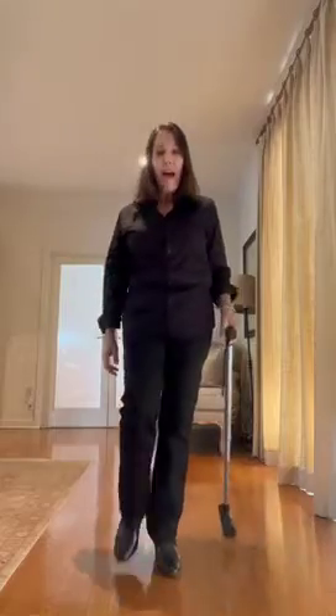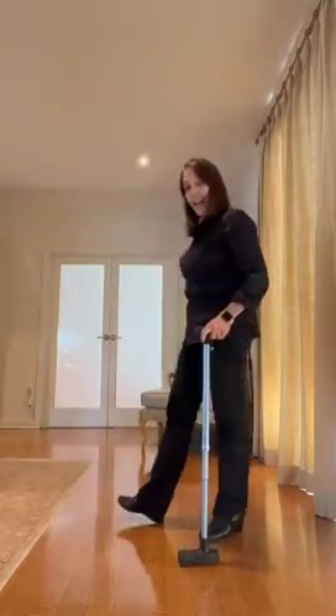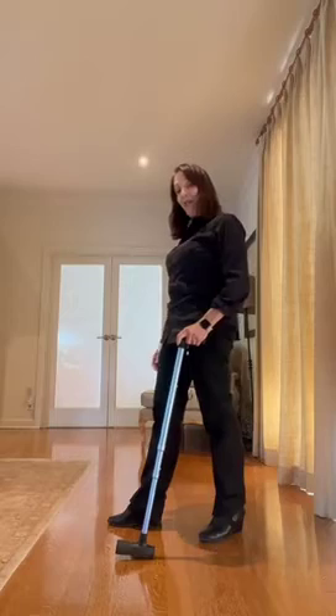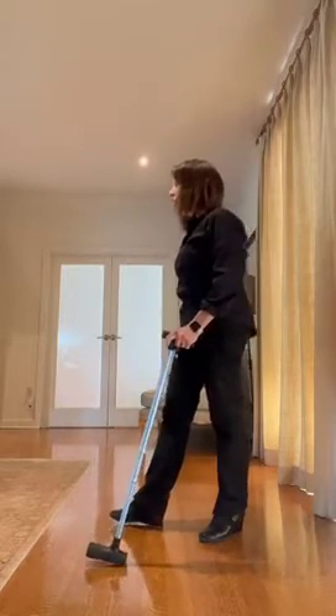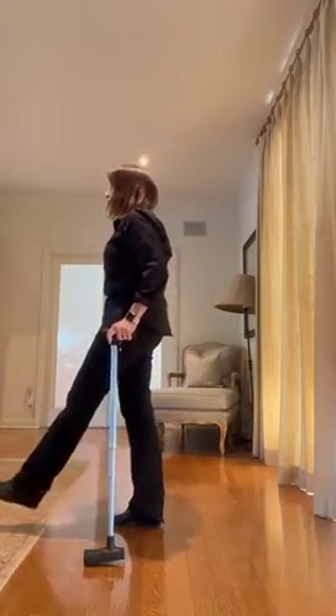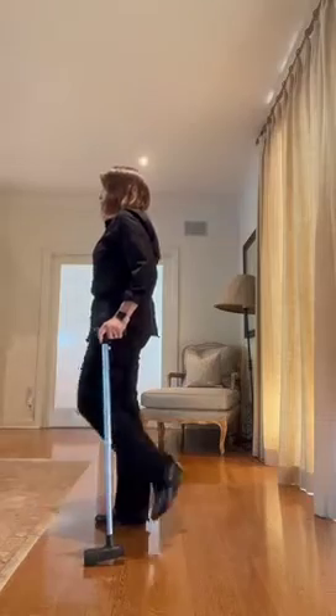It will maintain your upright posture, your balance, and your stability when you walk forward and even when you walk backwards — because the cane foot of the third foot cane is the only offset cane foot that maintains a second point of contact. So even when your leg swings forward and comes off the ground, you will still maintain your upright posture, balance, and stability.